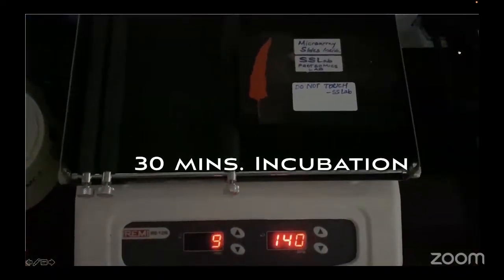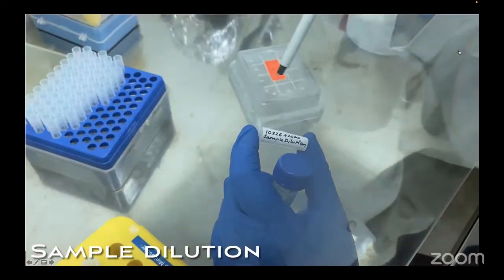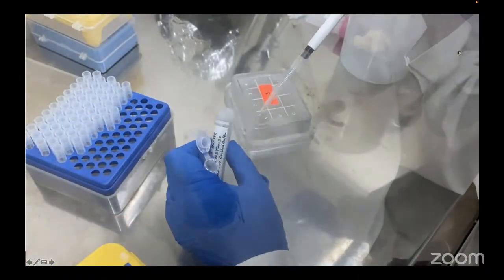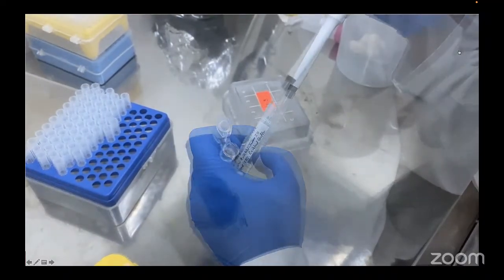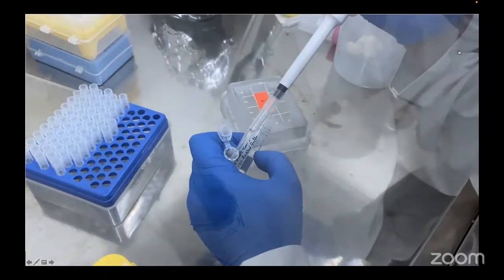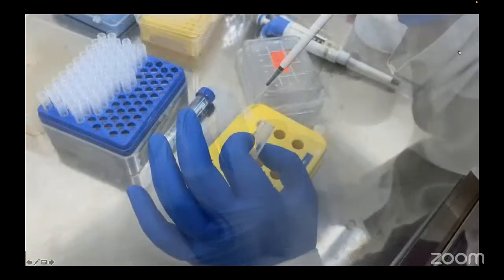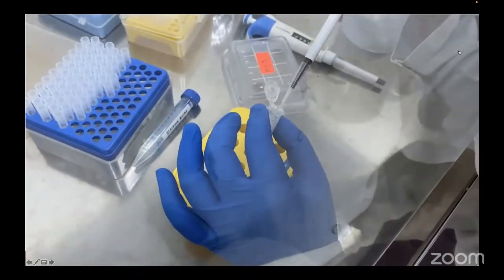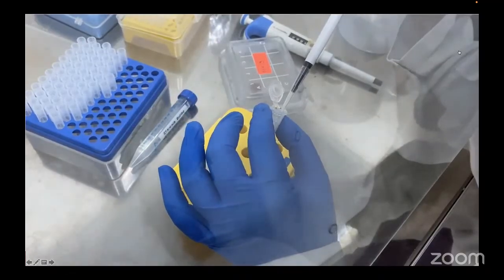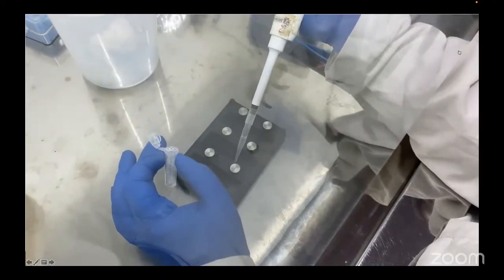The next step is sample incubation. To the staining buffer, we will add patient plasma at a dilution of 1:200. This is the patient plasma. Now slowly overlay the diluted plasma over the slide and incubate overnight.